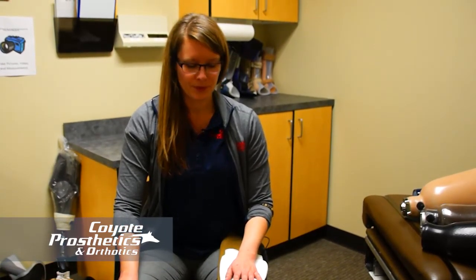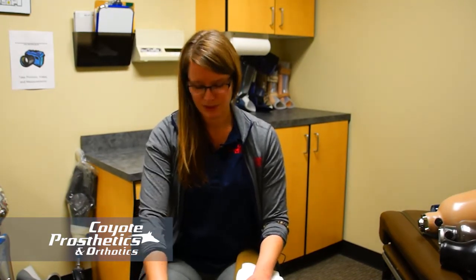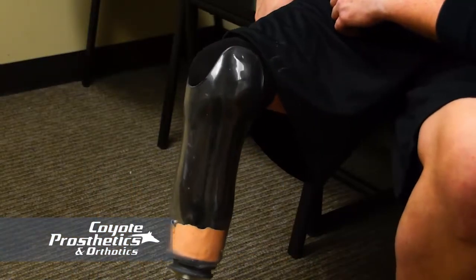If you're a new amputee, you're probably going to need to use socks more often. What usually happens in new amputees is that they have a lot of swelling, fluid, and things like that, and then once they start wearing the prosthetic, they get some compression, and the shape of their limb will reduce in volume. Also, there will be some muscle atrophy that occurs there, also reducing the volume of your limb. So sometimes new amputees can reduce in volume quite quickly.